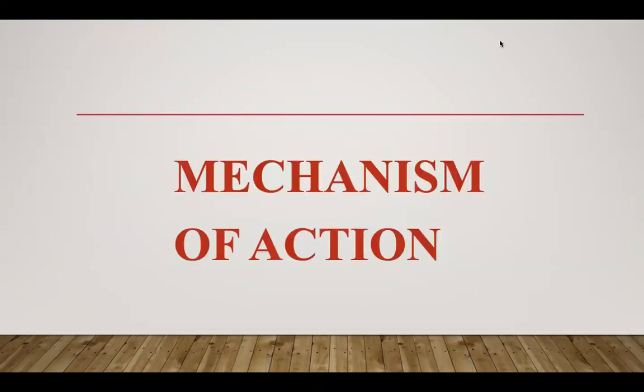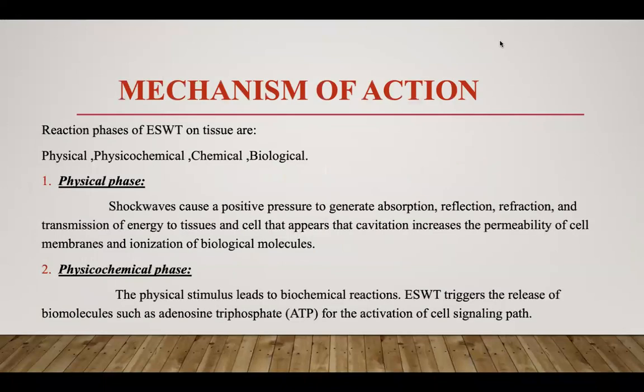Next, mechanism of actions. Let's start. The reaction phases of extracorporeal shockwave therapy on tissue are four: physical, physiochemical, chemical, and biological. First one is the physical phase.